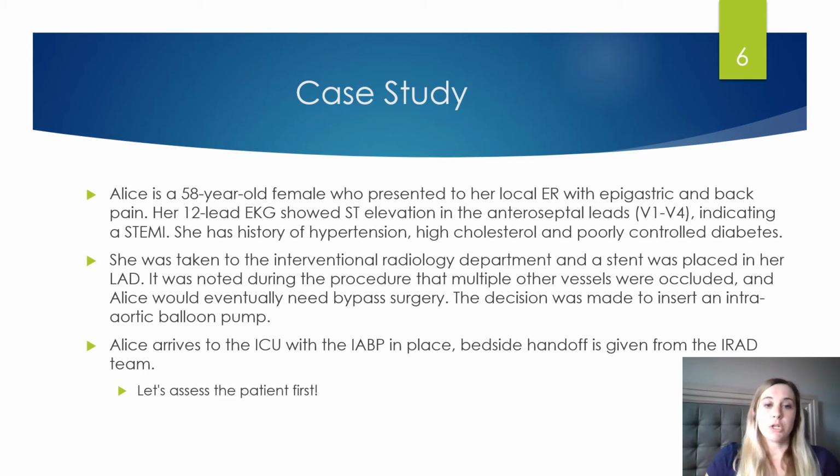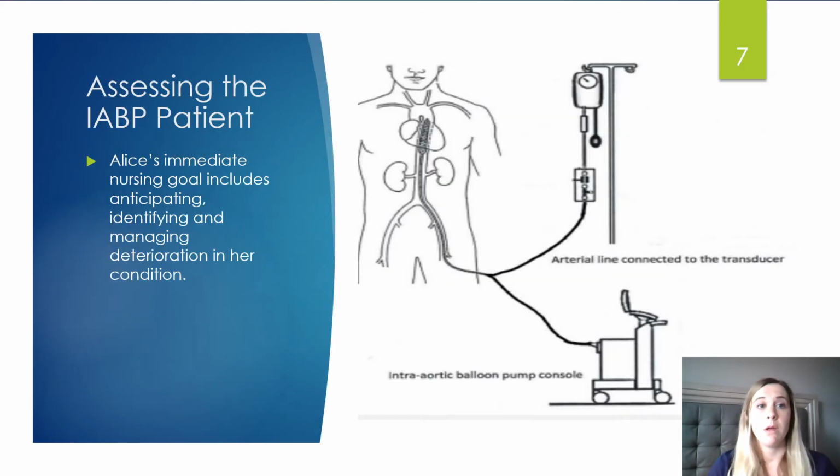So she arrives to the ICU, the balloon pump's in place. The primary nurse is going to receive handoff from the interventional radiology team. And this is kind of where we jump in and start assessing our patient. Let's look at the monitor and let's review the pump. And most importantly, let's take a look at our patient and see what's really going on with her.